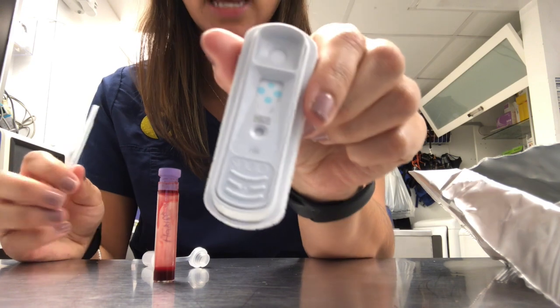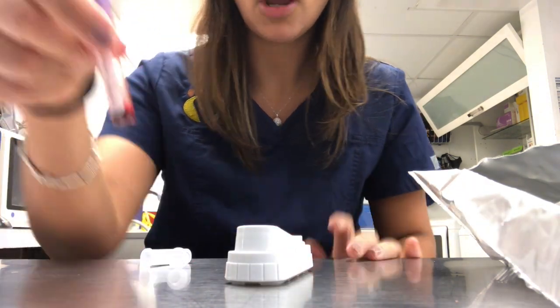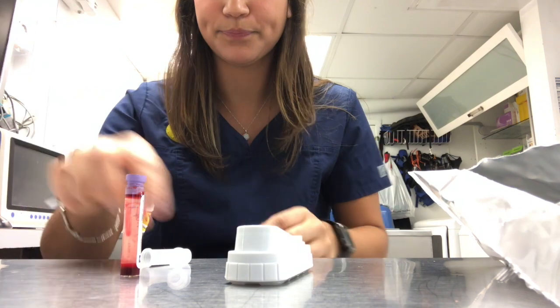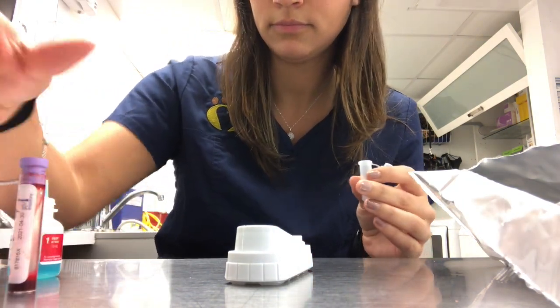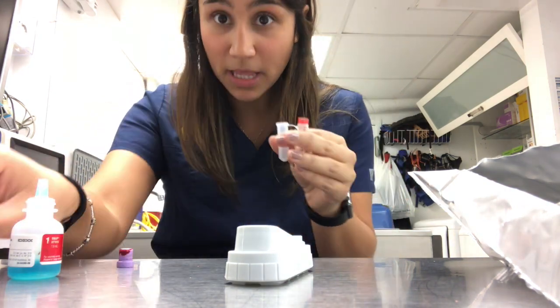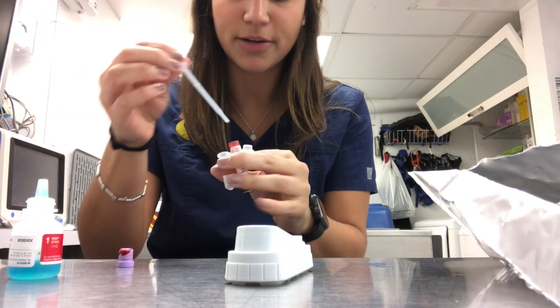So right here we have our test. We have our pipette, our blood, which is in an EDTA tube, and our conjugate that we're going to be mixing the blood with. So first, I will add 3 drops of blood into our tube here. We're going to be mixing the blood and the conjugate together.